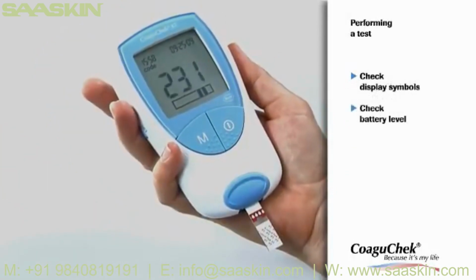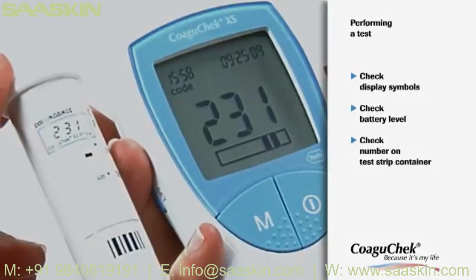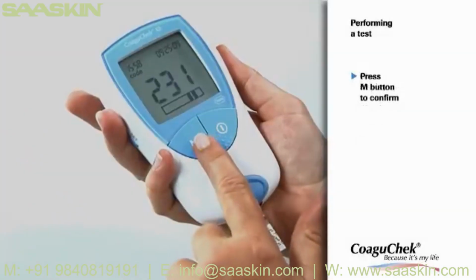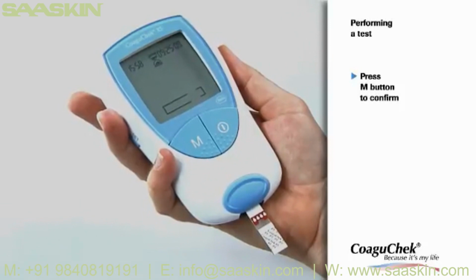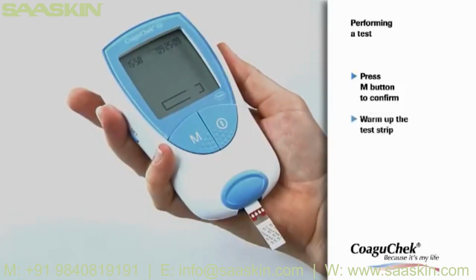The code number of the code chip inserted is displayed. Make sure that this number is identical to the code number printed on the test strip container. Please press the M button to confirm that these two numbers are identical. Using the wrong code chip can produce inaccurate results. The code number stops flashing and the test strip is warming up.